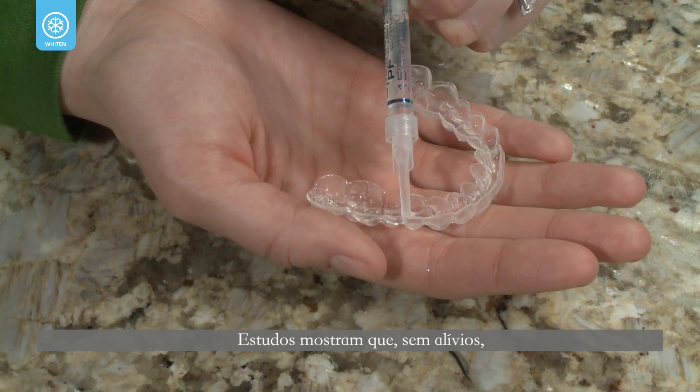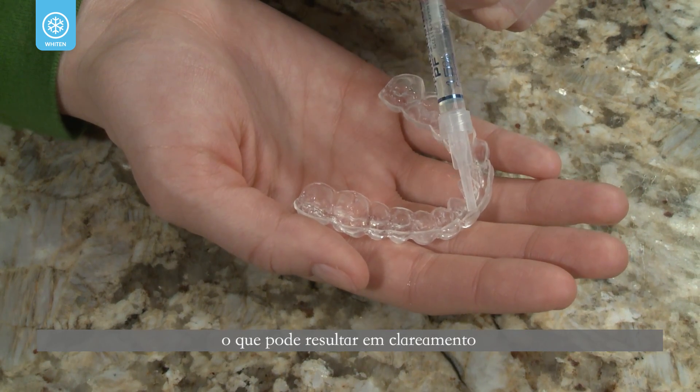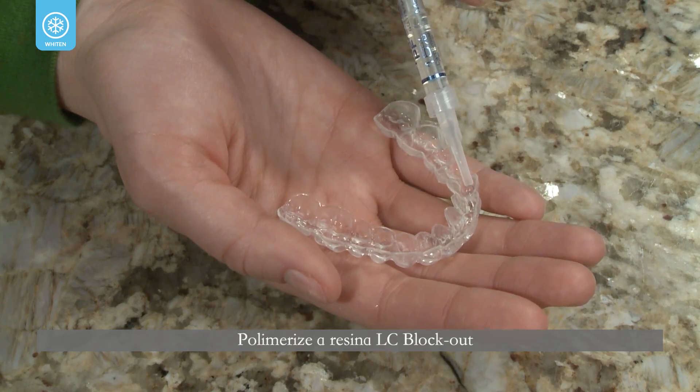Studies have shown that without custom reservoirs, the likelihood of losing bleaching agent is greater, which may account for low bleaching potential.